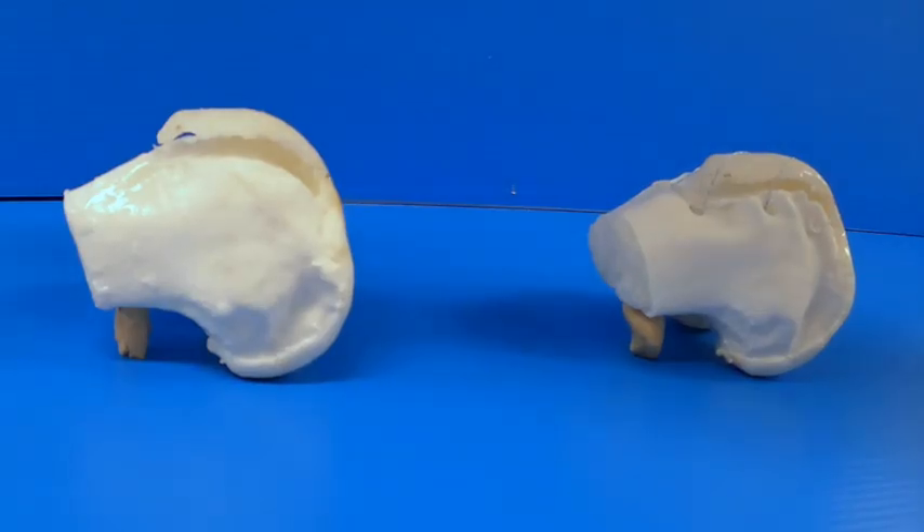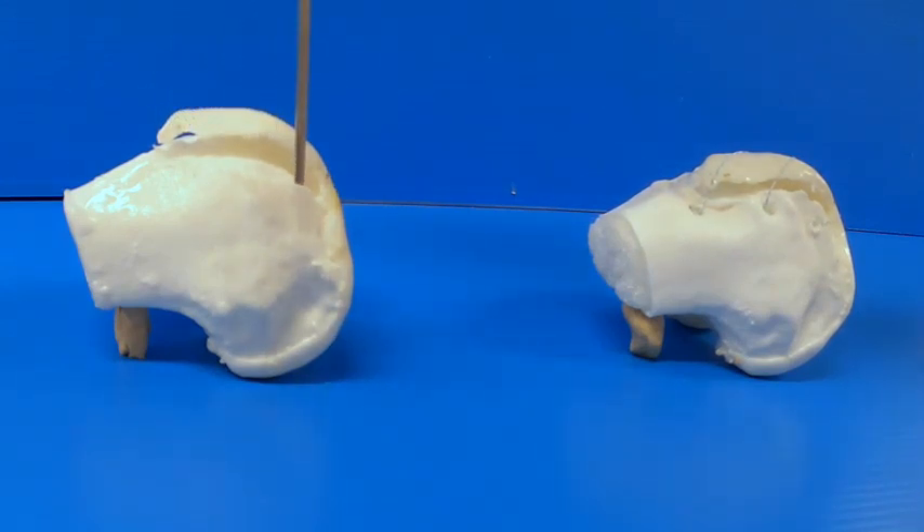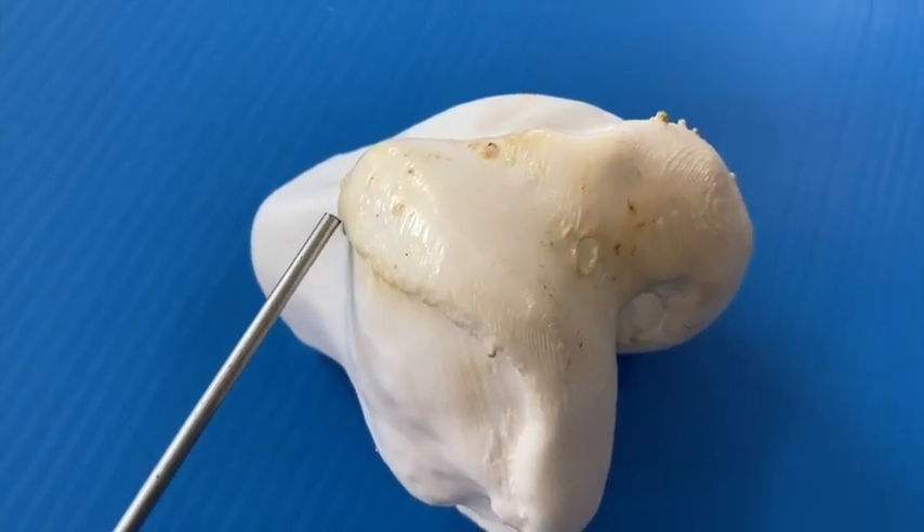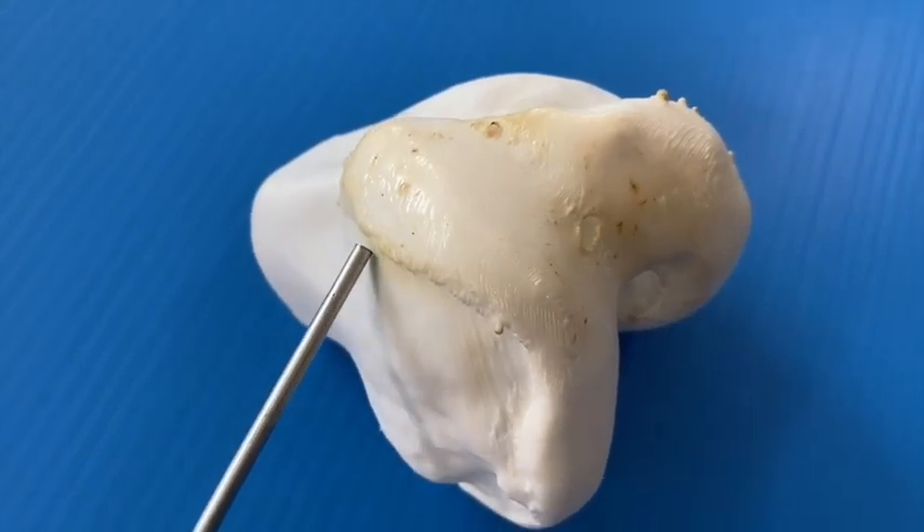Final 3D printed products representing aberrant trochlear morphology from two different patients are shown. The prominence of the supratrochlear bump on the medial aspect of the trochlear ridge can be easily visualized on the lateral view. We also highlight this bump and its variable height and shape using a metal probe for visual purposes.